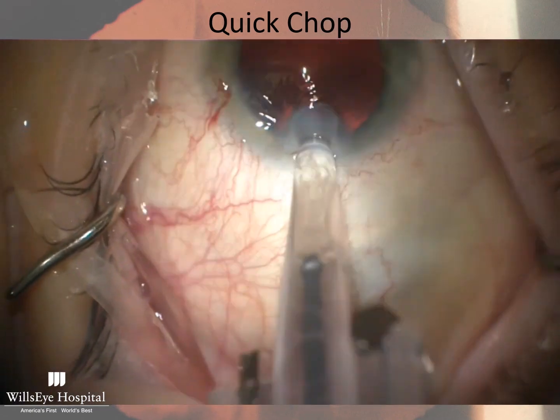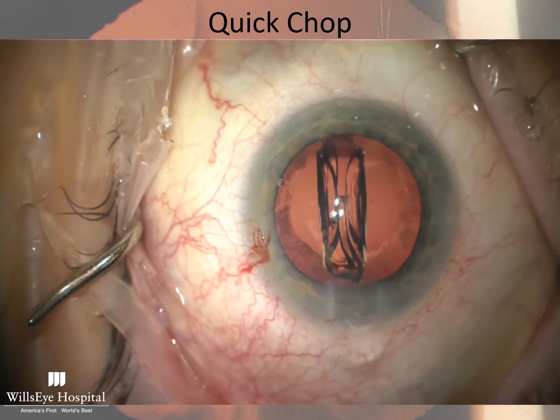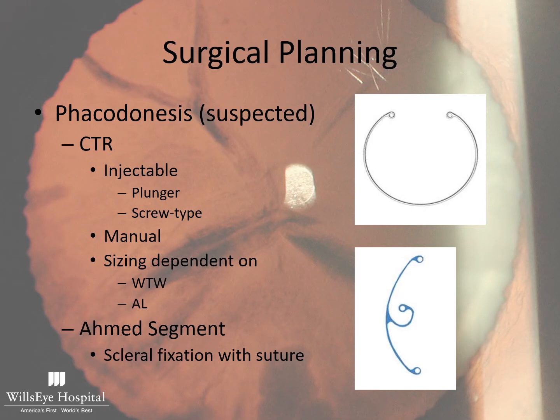So I've done the cortical cleanup with bimanual IA, and here's the lens going into the eye. If you have phacodenesis or suspect phacodenesis, you need to be prepared for it. In general, if you see it on examination, it's going to be bad inside of the eye. So you want to be prepared to do an anterior vitrectomy and have some sort of scleral fixation.